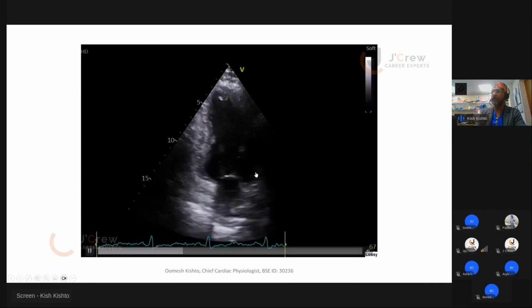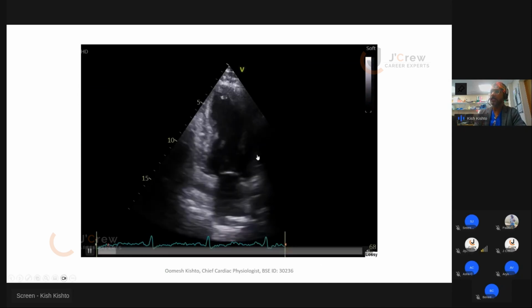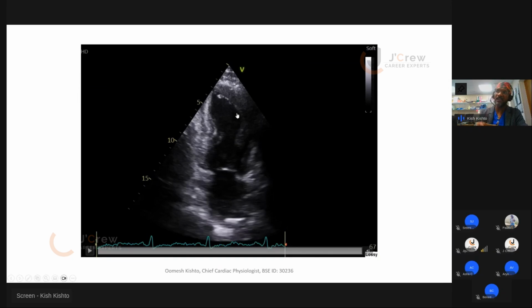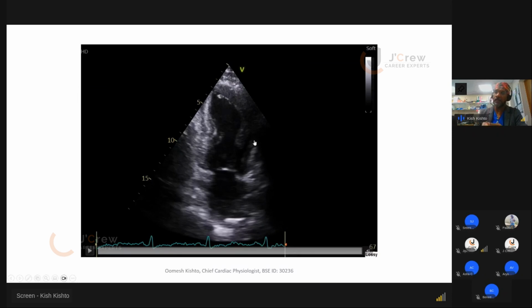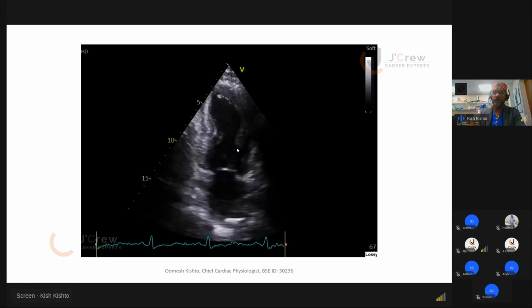And here this is the four-chamber view. As you can see here, not great. I can't see the wall clearly, but good enough for me. And that wall is thickening a bit, but the anterior wall is akinetic. So bear in mind, depending on where your patient is, whether it's an outpatient or ITU, it depends how well you can see, based on body habitus and everything.